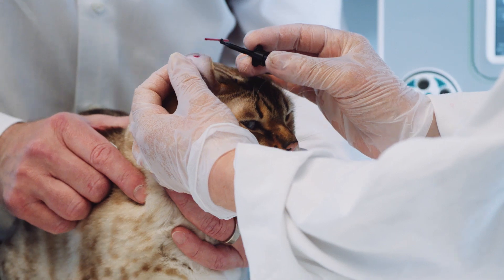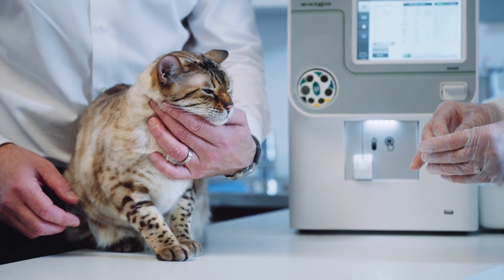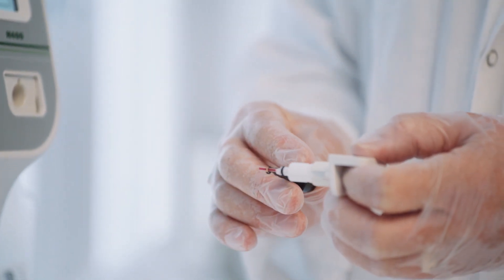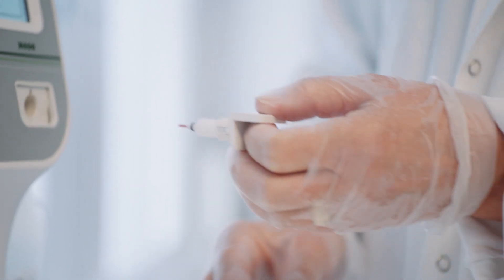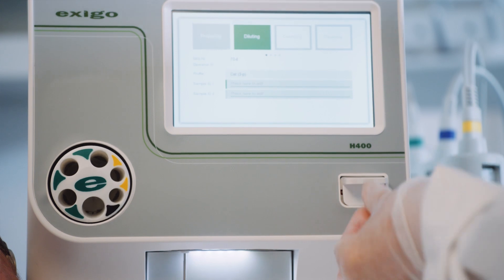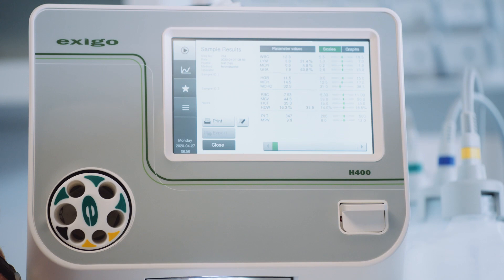Exigo H400 is the only analyzer available today to offer its unique feature, the micro-pipet adapter, MPA, where you introduce a small drop of capillary blood directly into the analyzer. This means an entire CBC plus three-part differential from just 20 microliters of blood.